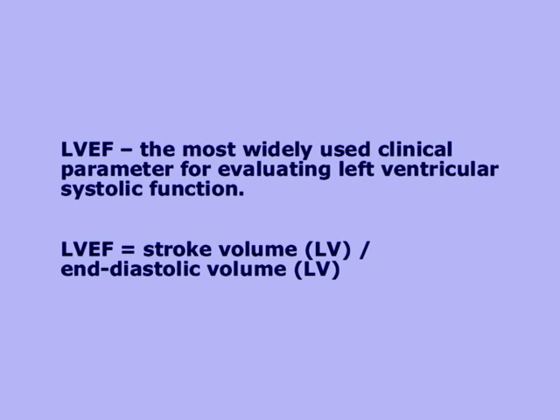Ejection fraction is the most widely used clinical parameter for evaluating left ventricular systolic function. To calculate ejection fraction, many echocardiographic methods have been proposed, but none have received universal acceptance.